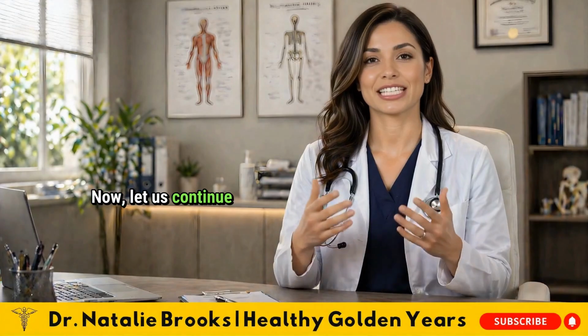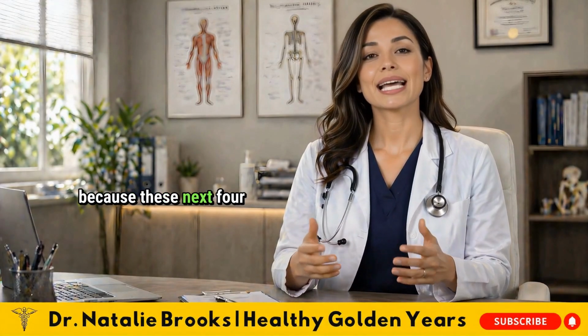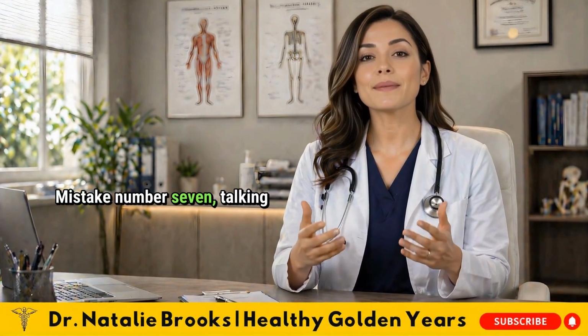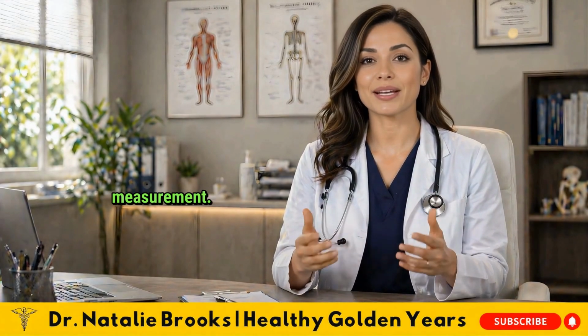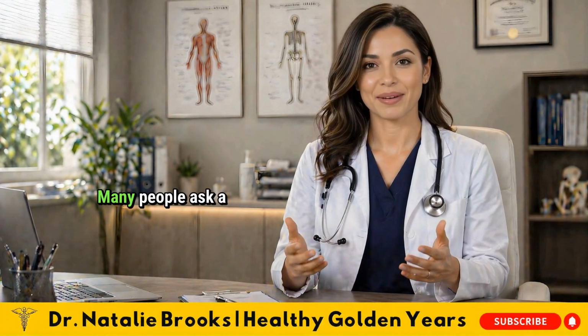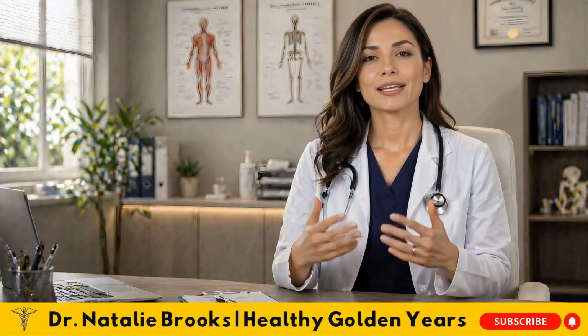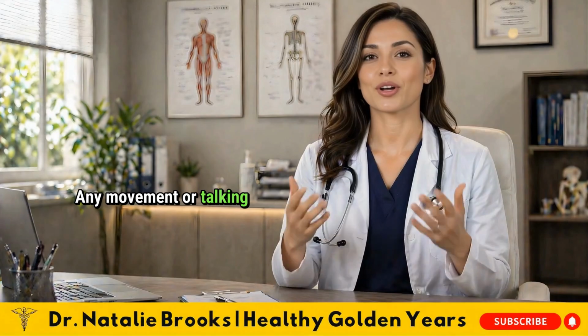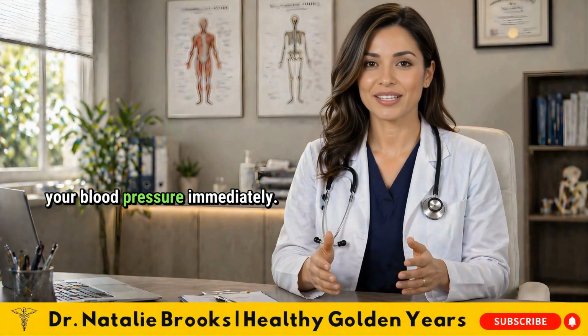Now, let us continue with the remaining mistakes because these next 4 are the ones most people never hear about. Mistake number 7, talking or moving during the measurement. This seems obvious, but it happens constantly. Many people ask a question, turn their head, shift position, or even laugh during the reading. Any movement or talking during the measurement raises your blood pressure immediately.